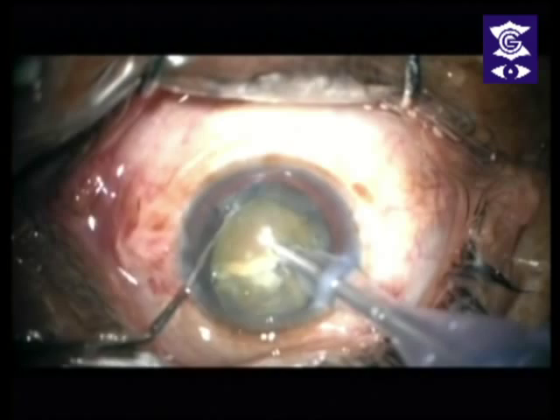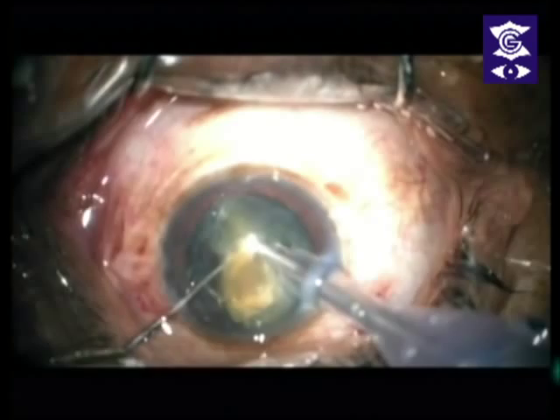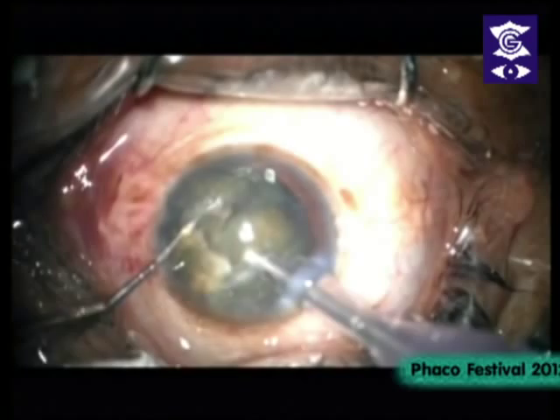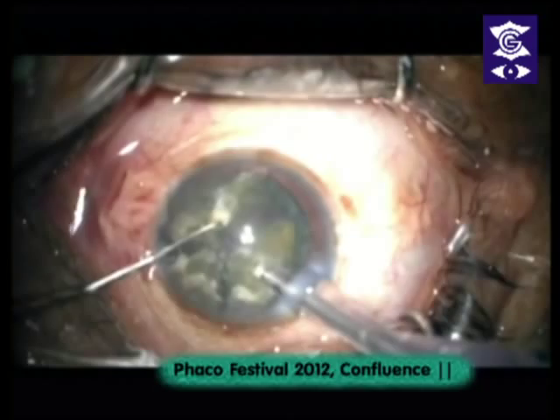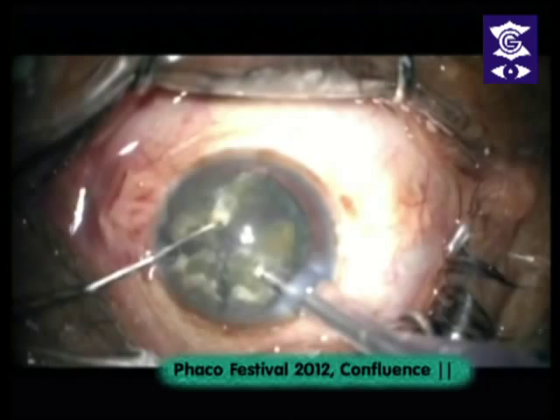What I do in most of these slightly firmer cases is get one quadrant up like this. You can see that this cataract is being held by the posterior fibers — these are the posterior fibers holding the cataract together. So we try to split them apart, and then the rest of the cataract will just meekly come out.